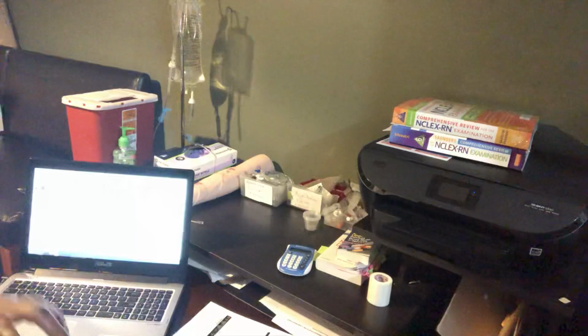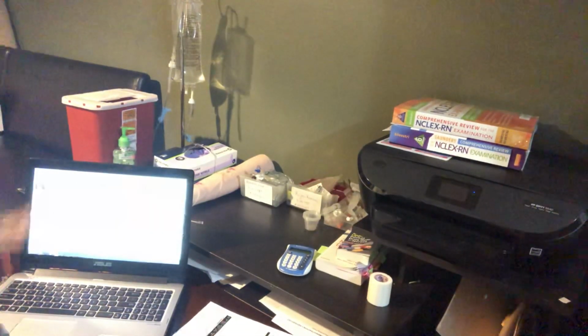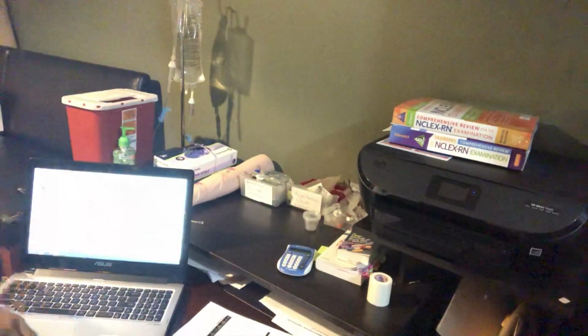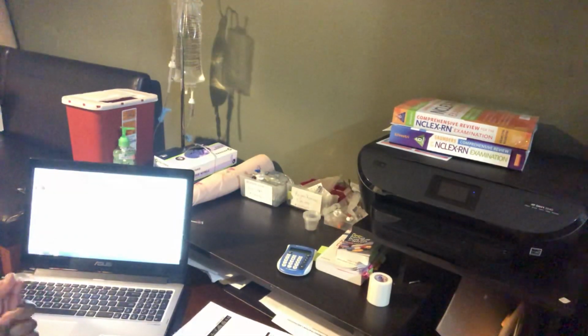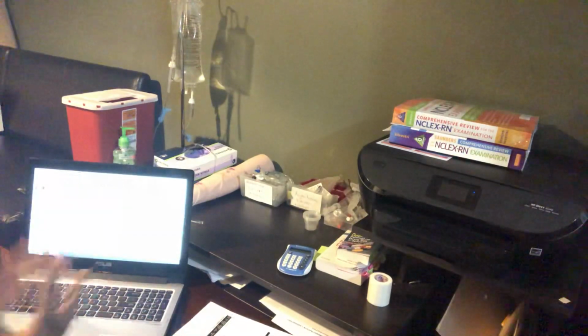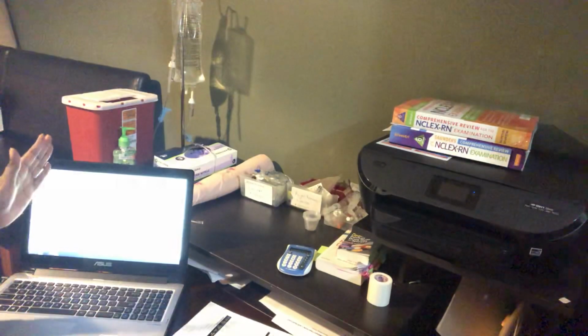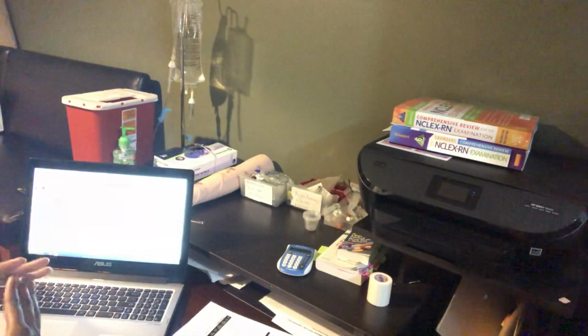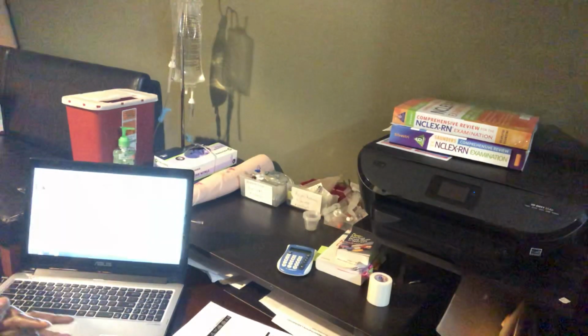I have an extra medication that I'm going to give. I'm going to do the IV mini bag, and I'm also going to do an IV push. I'm going to try to get done with all of these within 35 minutes, because I know if I do an extra minute and I get done within 35 minutes, then I'm guaranteed, as long as my drop factor is not acting up, to get done before 35 minutes.